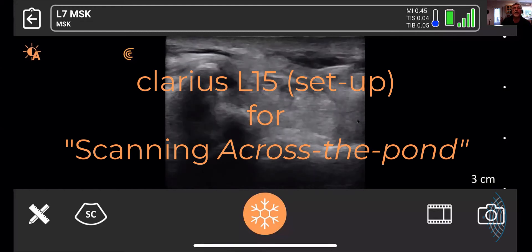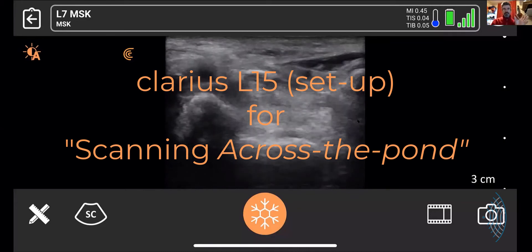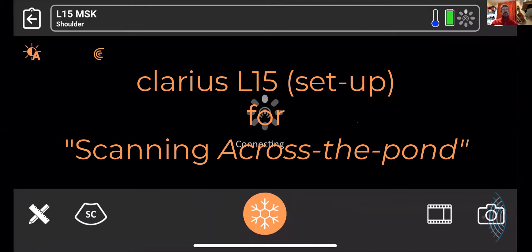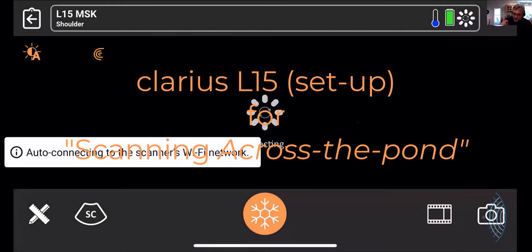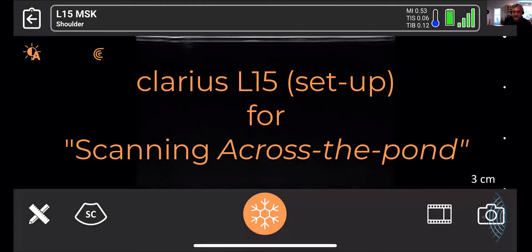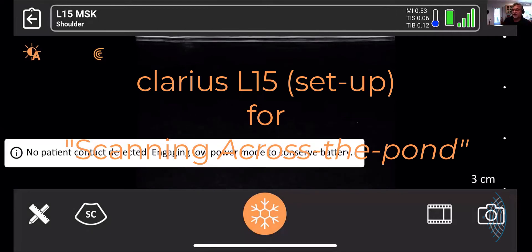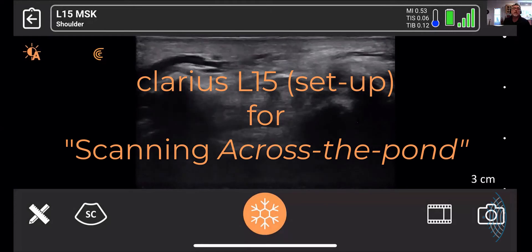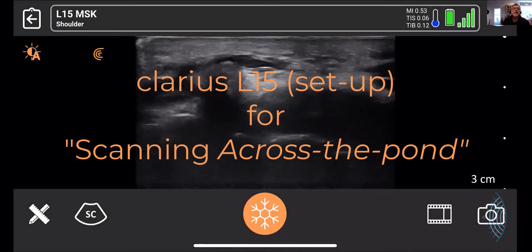I'm using the seven John. If you use the 15, I'll go to 15 right now so I can make a sort of direct comparison. Obviously our wrists are not the same but I can make a direct comparison to what I'm familiar with. I wished I better understood in conversational fashion the way you place probes on things, because I revert by nature to always throwing that sucker to the right. I want to learn how to make sense of your way, but right now you're going to have to just work with me on my way until I learn the right way.